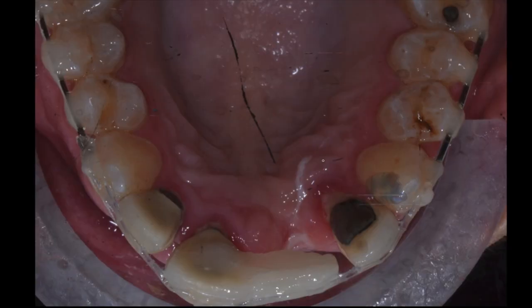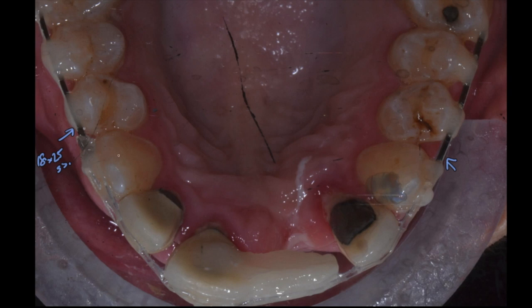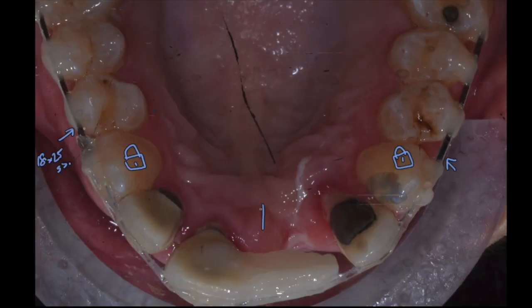This is what I did. Here's an occlusal shot - let me walk you through it. I've got an 18x25 stainless steel wire here. It needs to be a nice strong wire that's not going to flex and there are no brackets - we're literally just gluing this wire onto the teeth with composite. The reason is anchorage. If we've got all these teeth here, this tooth is effectively locked into position. I don't want those teeth to move. If we want to pull the front teeth back, there's going to be a force of the back teeth coming forward which we want to resist. That's the reason for anchoring that far back.